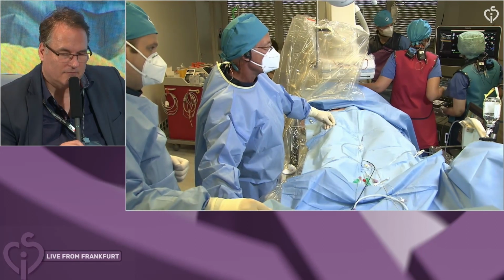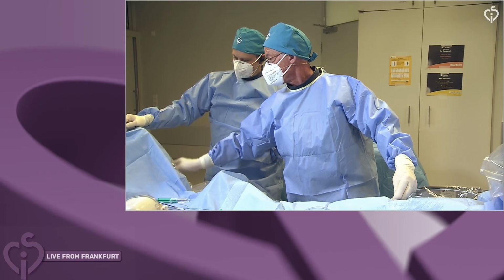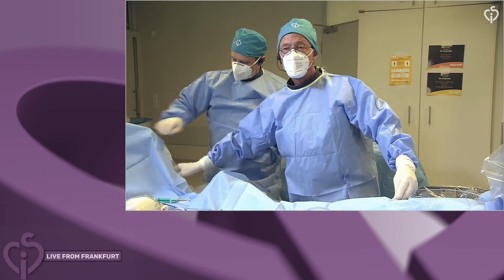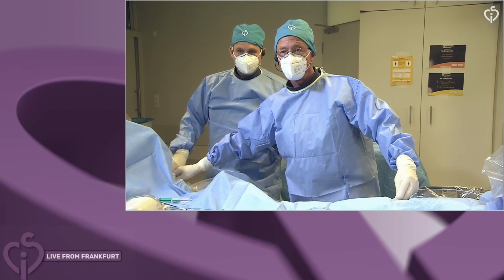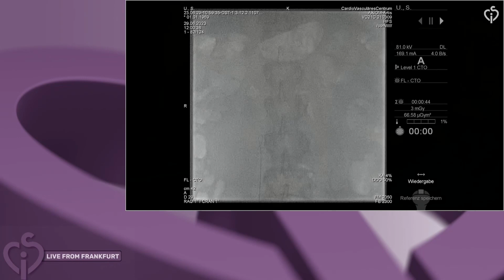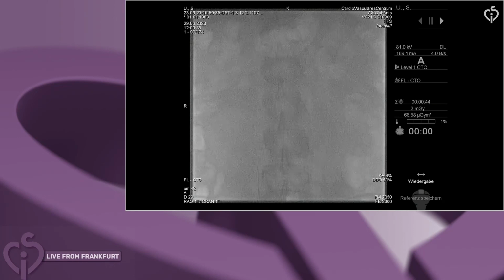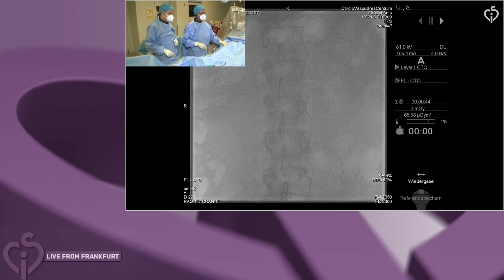So let's focus on some details here. Those of you who are working in the structural field know this, but those working only in the coronary field may not. When I inserted the wire, I felt some resistance at the level of the iliacs. Look at the fluoro, please. You can see that the wire is going up easily, but then it got stuck there. This is obviously the azygos vein, so you have to pull the wire back, rotate the catheter, and usually go a little bit more medial, as you see here, and now it's going up into the IVC.